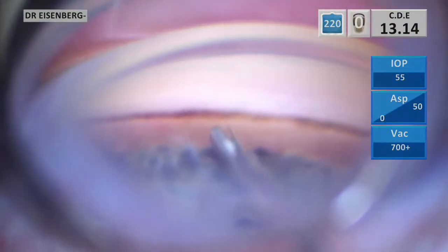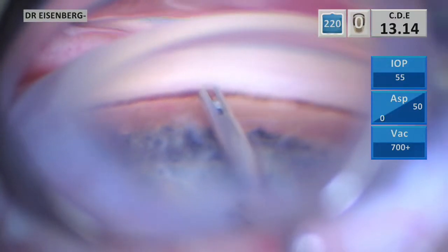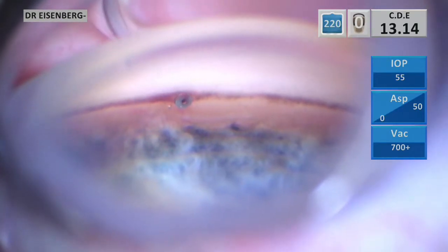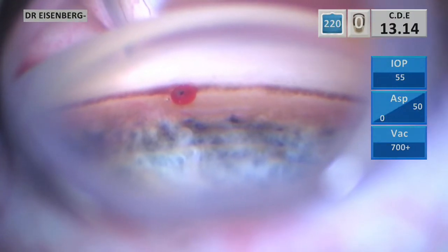I have a beautiful on-axis view, well-defined TM, and look at the scleral spur there. I'm going with the trocar just over the spur — small indent and punch. Here's a nice high-resolution view, and you can see I've highlighted the scleral spur. Notice how the flange of the Inject is actually below the scleral spur — it's posterior.